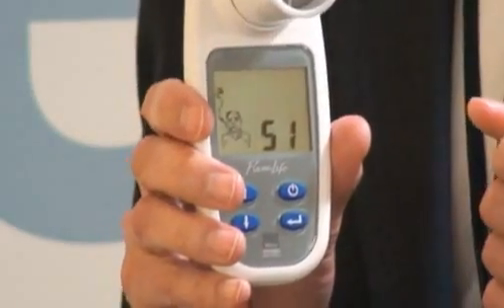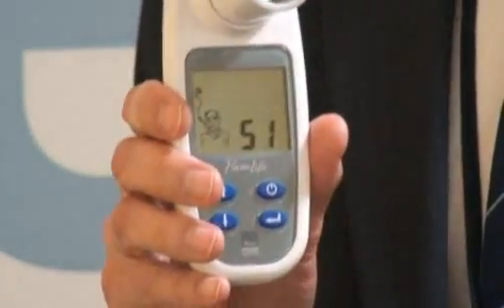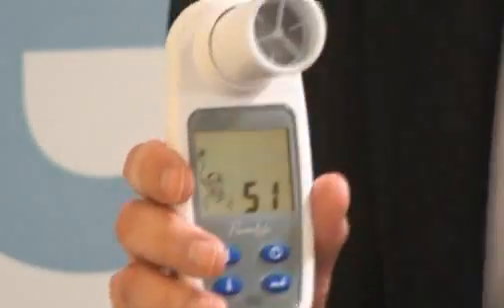This is a really useful tool for smokers. As you can see, it's got a picture of a smoker there, and my lung age has come out at 51, which isn't so great.